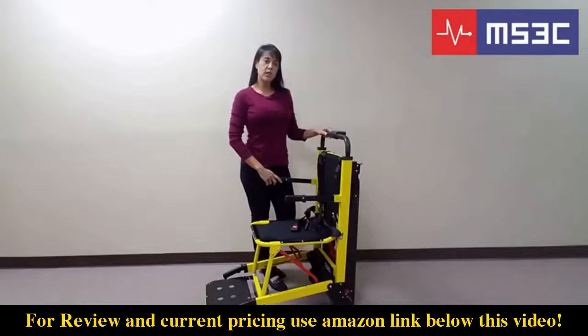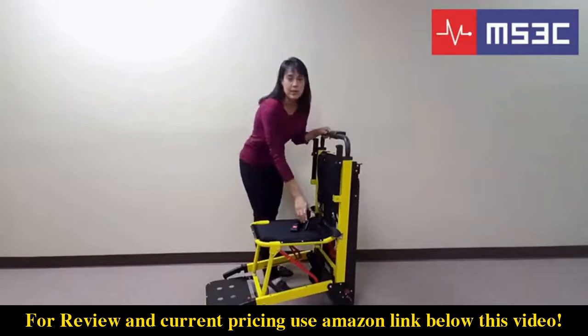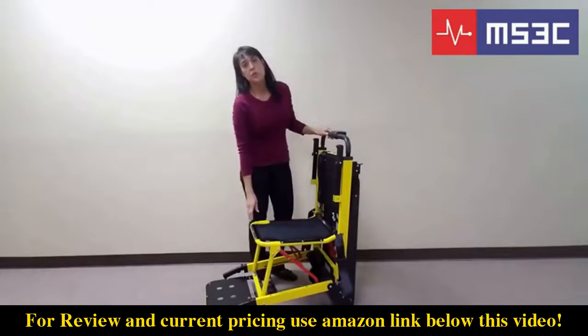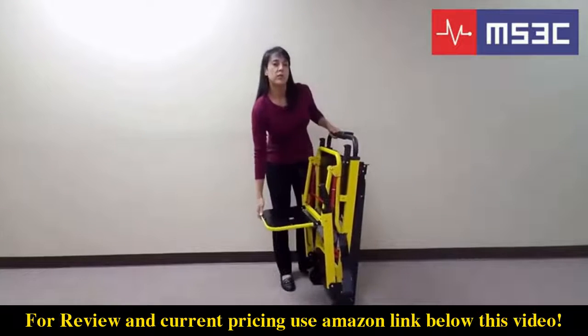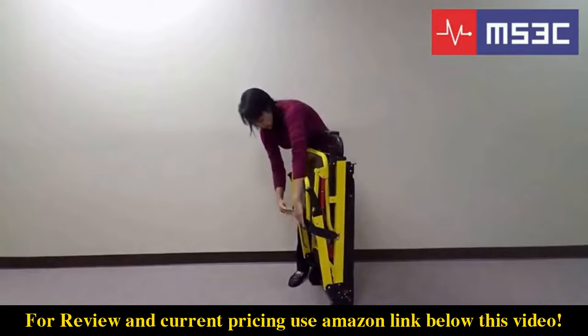To close and store the chair, raise all of the support handrails. Release the seat belt and make sure it is outside of the chair seat. Next, you will tilt the chair back and pull the red release lever located under the seat. Close the footrest. Then use the seat belt to secure the legs closed.